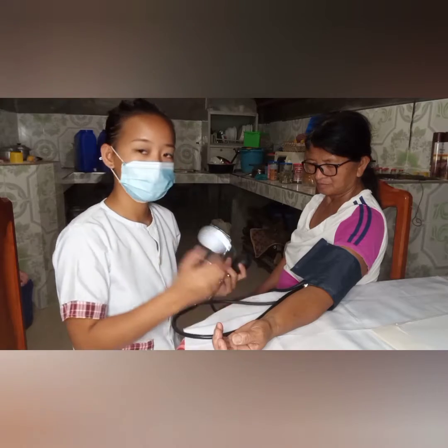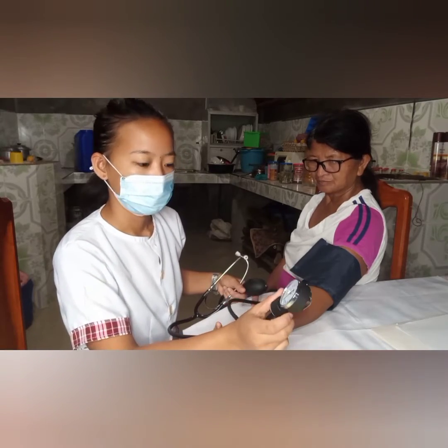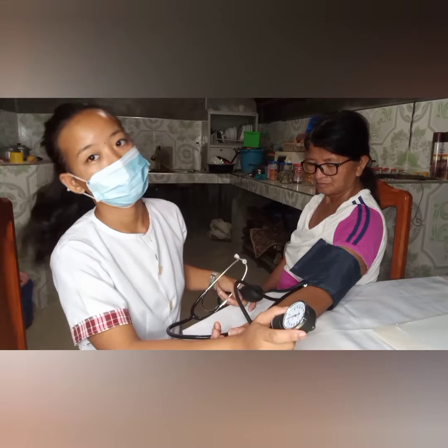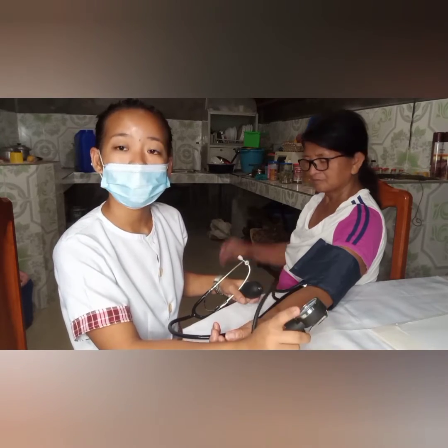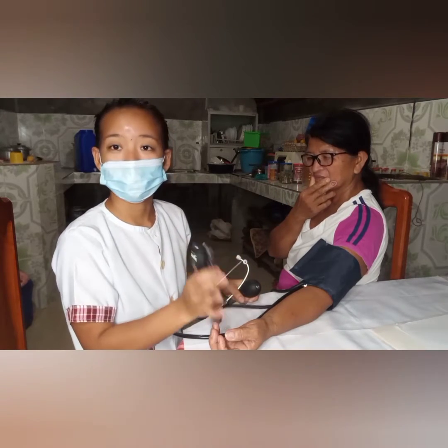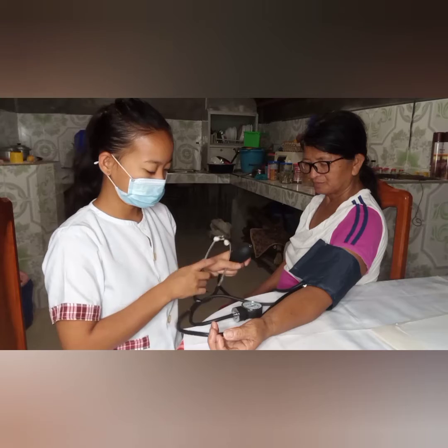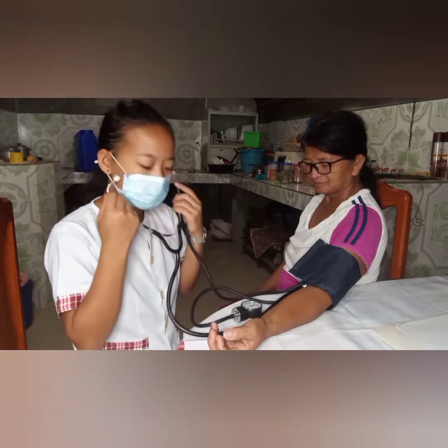And note that this gauge is very helpful because this will allow us to see and know the diastolic and systolic of the patient. The normal systolic and diastolic, or the blood pressure rate of the patient, is 120 over 80. We have to put it over here where we can see it more properly. And let us now wear our stethoscope.